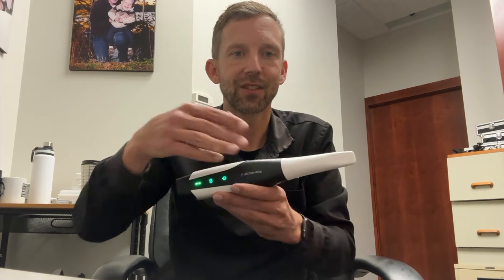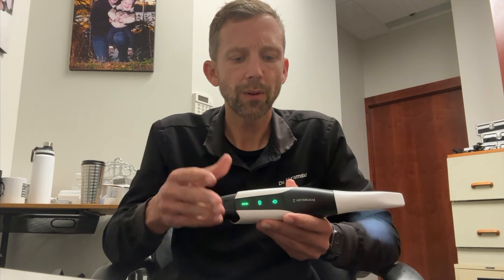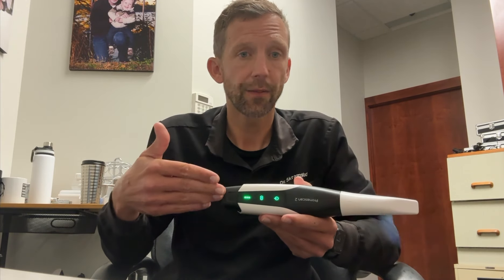Hi everyone, this is Mike Scramstad and I want to make this video real quick just to talk a little bit about my experience with the PrimeScan 2. So here's the PrimeScan 2. You guys have already seen it, you've heard so much about it, but I thought I would just give you some insight into what this has done for my office.